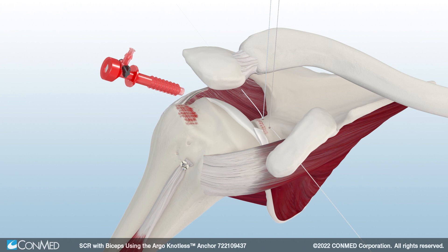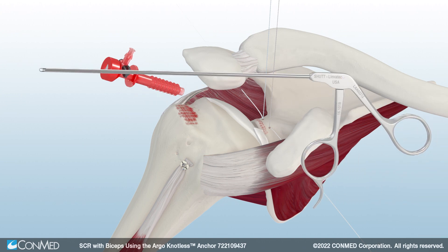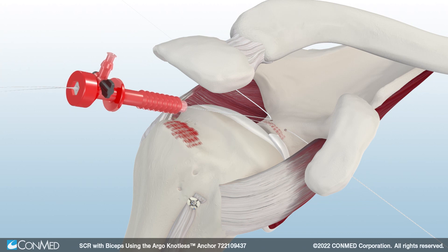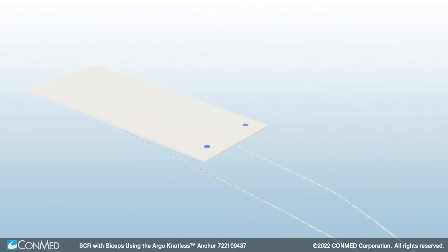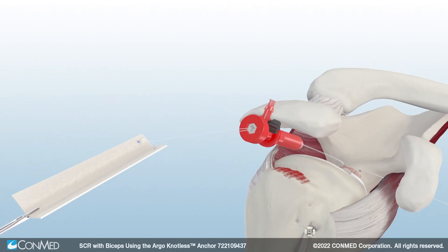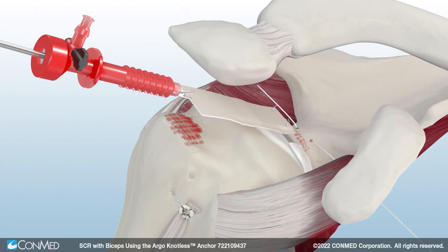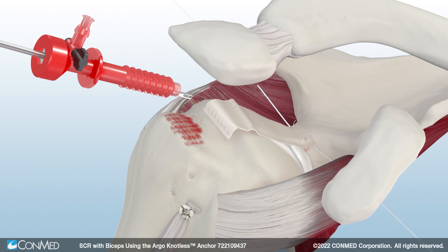Using ConMed's red 8mm dry-dock cannula, pull one limb of suture from each glenoid anchor through the lateral portal. Pass the suture limbs through the Allopatch HD, tie 5 stick knots on each limb, and trim the excess. Next, lightly fold the graft in half and use a grasper to assist with passage through the cannula.